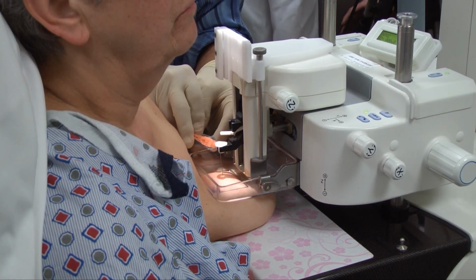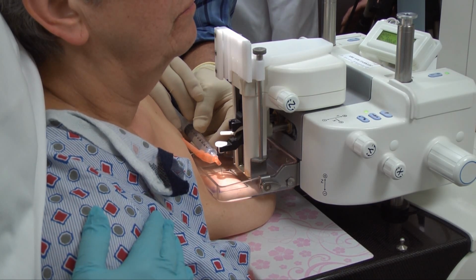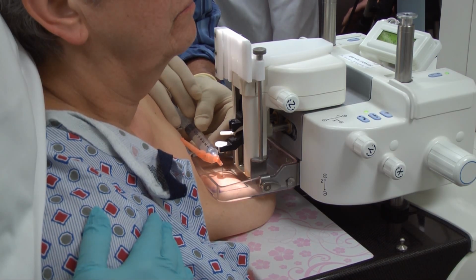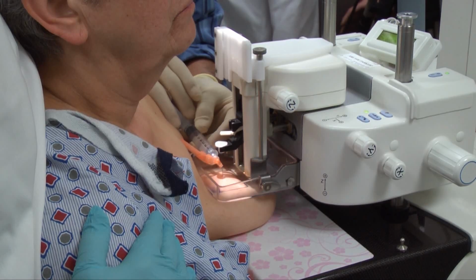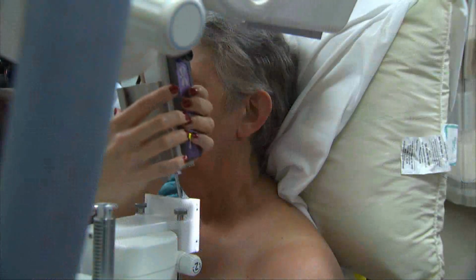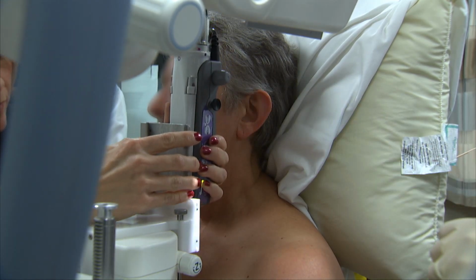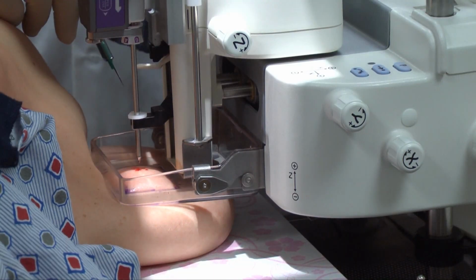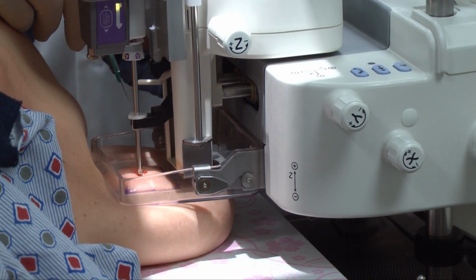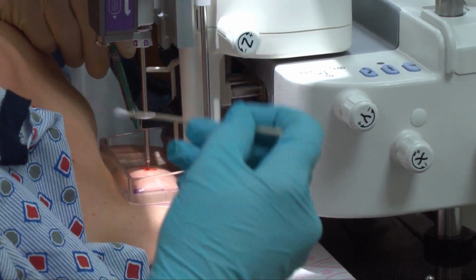So we're going to go real slow. And we're going to tell our patient we're going to give her more local. And this, you really have to have patience because you don't want to push the calcifications. So I'm going back and forth giving the local. The probe and holster are locked into the probe guide holder. I'm going to turn the clock so that this is at 3 to 9, and I'm going to go back one more time, make a little nick, and now I'm going to make my skin incision.